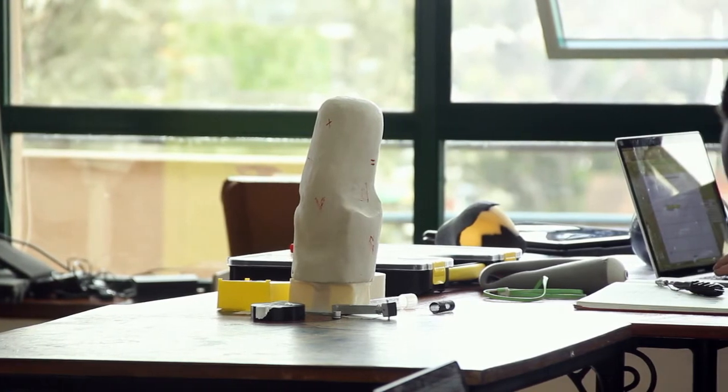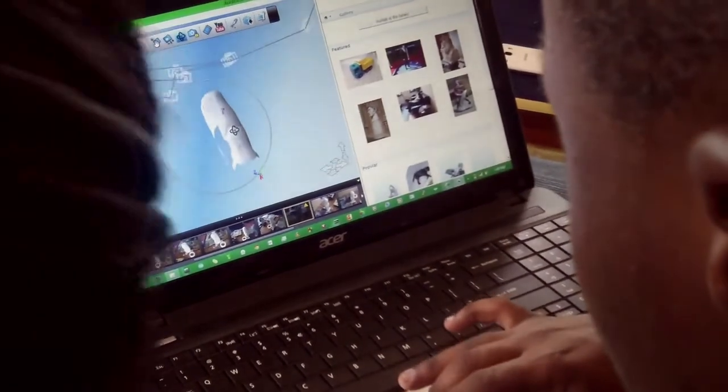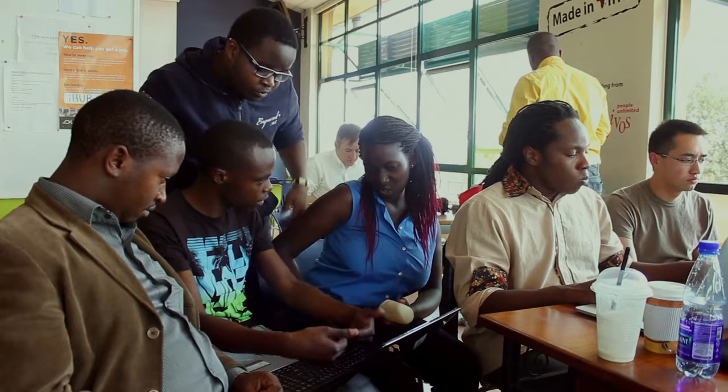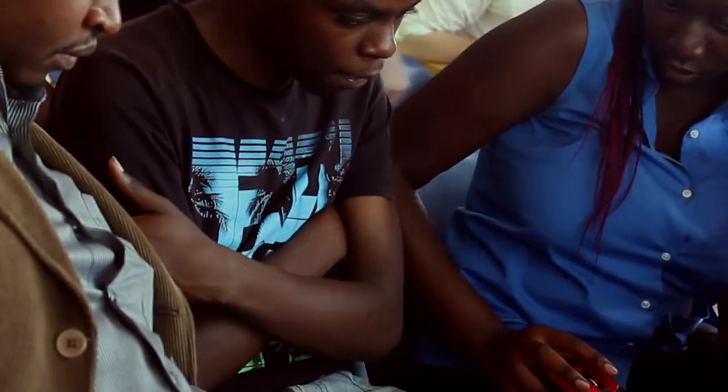We can use cell phones and pictures that we have access to create digital files that we can edit to create 3D images and 3D print prosthetic sockets. The most exciting part of this has been watching students from Kenya learn the software, learn how to go about doing the edits, working directly with the prosthetist, trying to understand why the prosthetist does what he does. And the hope is that in the future we are able to have them continue doing this independent of people from the Media Lab, independent of external agents.